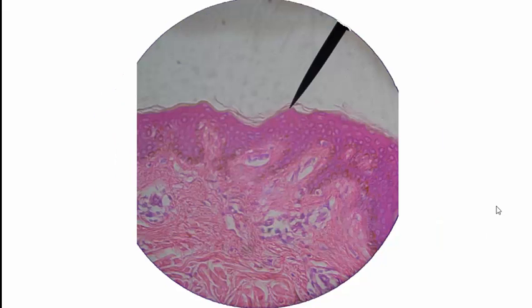This is thin skin at high magnification, and now we could go through the five major layers of the epidermis on skin. This outermost layer where you can see the flakes, that is stratum corneum. There's no stratum lucidum for thin skin, so no stratum lucidum. The stratum granulosum would be these cells that are just south of that stratum corneum.